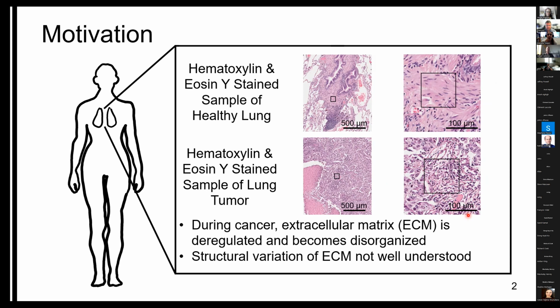to characterize. So pathologists typically characterize and diagnose cancer by visually inspecting tissue biopsies dyed with hematoxylin and eosin, known as H&E, and they use a bright field microscope. And so they look at images that look somewhat like this, where they use hematoxylin to stain nuclei, this purplish blue color, and they use eosin to stain the extracellular matrix, this pink color. But misdiagnosis often occurs due to variability in morphological interpretation of the tissues.